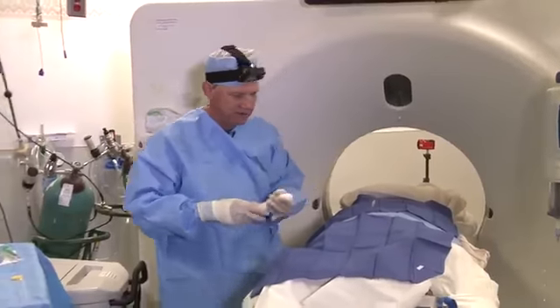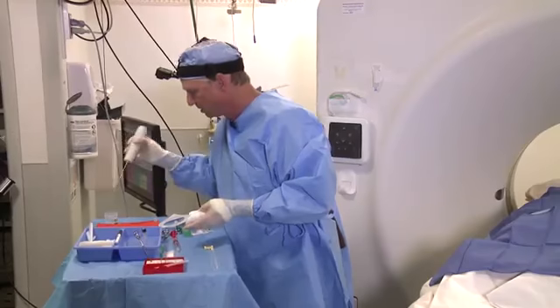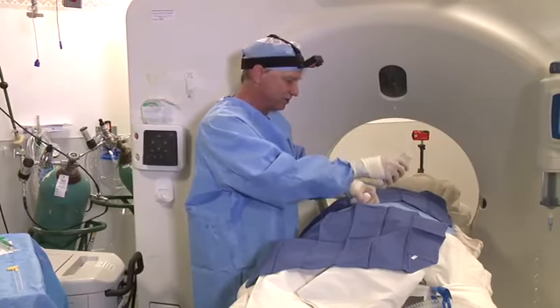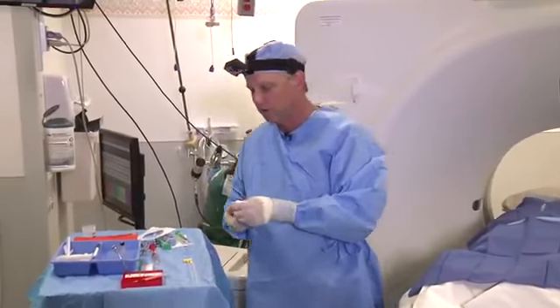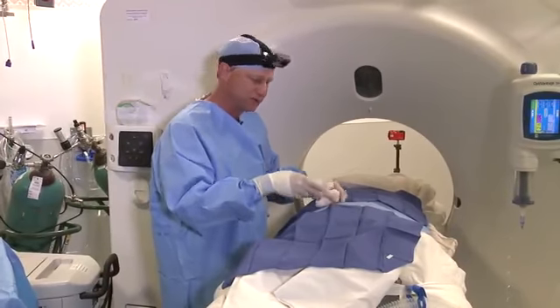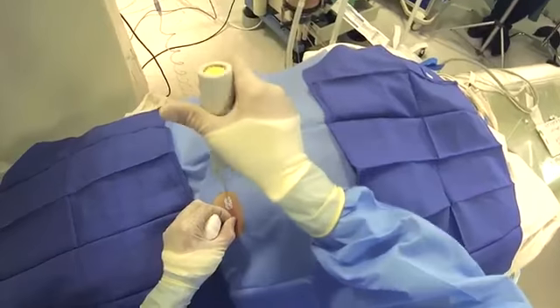I don't skip on the biopsies. Again, I mentioned the chromophobe adenoma, the oncocytoma controversy. Pathologists tell me that those tumors can actually have benign versus malignant centers and can be very hard. So it would be wonderful for this guy if at the end of the day this proves to be a benign tumor. Again, statistically very unlikely. But while we're here, no reason to skimp on the biopsies.